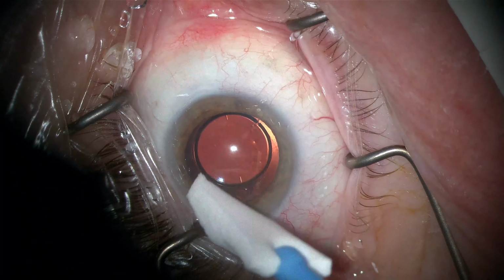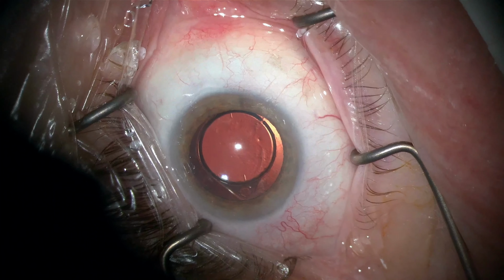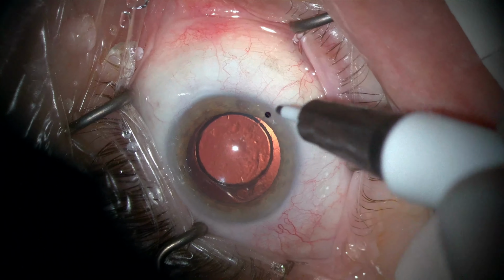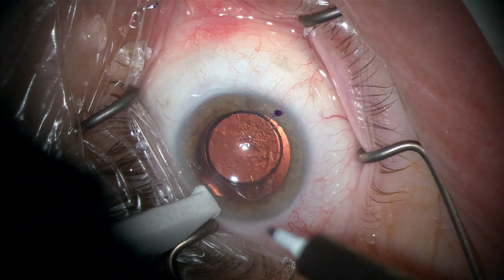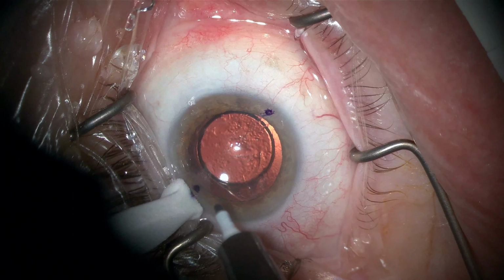And I used the Mastel toric marking system in the preoperative area, which allows us to put indentation marks on the cornea. So when we get into the operating room, the cornea is already marked in the proper axis. And I like to augment these marks at the start of the case with just a marking pen to make sure that we don't lose those marks.